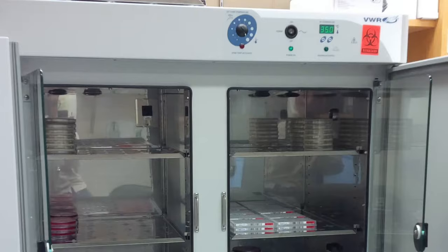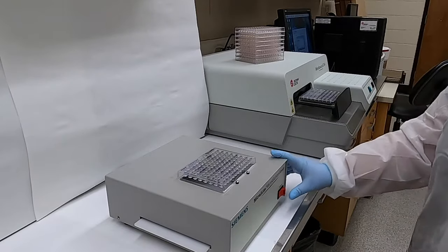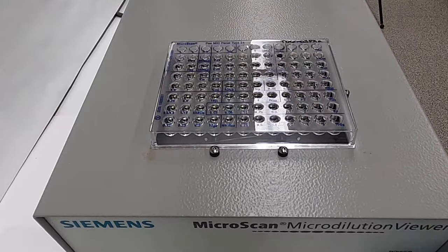Once the 96-well plate has been inoculated, it's ready for incubation. We do that overnight at 35 degrees Celsius and ambient air and then our plate is ready for reading the next day.